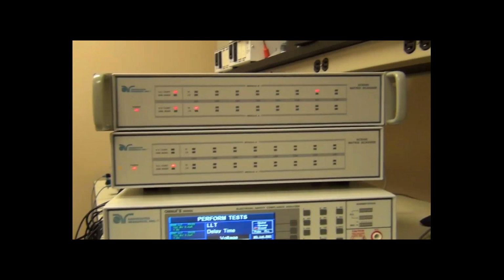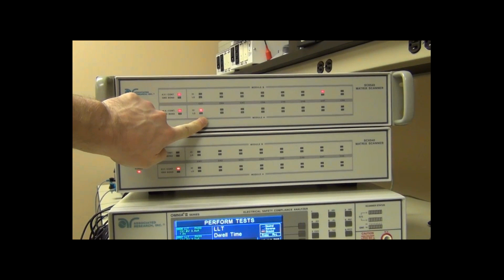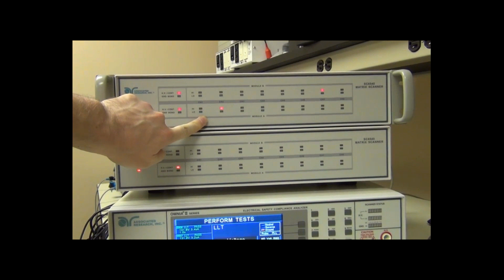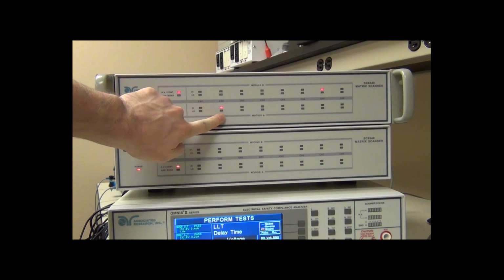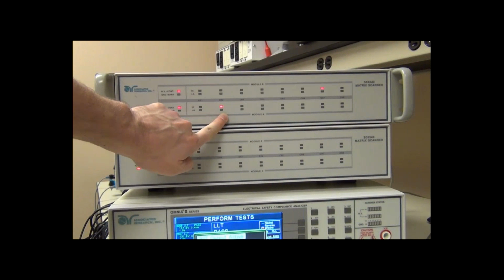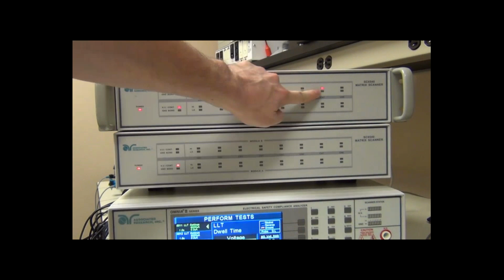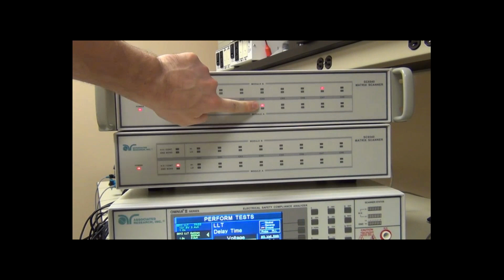So here we can see probe high to patient lead 1, probe high to patient lead 2, and remember probe high is channel 15, so that's just connected to patient lead 2 here. Probe high to patient lead 3, as this LED goes on, still connected to my probe high to patient lead 4. Then we go into our patient auxiliary tests after this one.